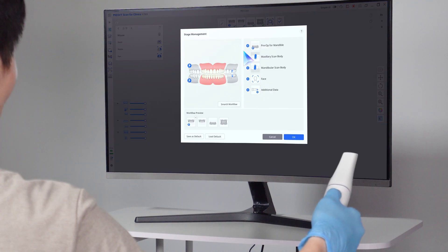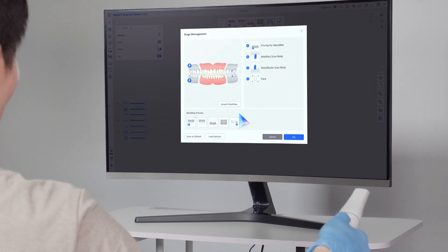Hold the scanner like a remote and move it as you would with a mouse. Now, let's control the scan data using the Air Mouse.